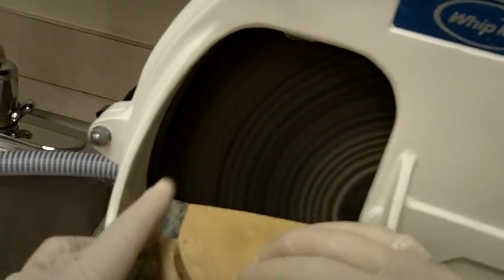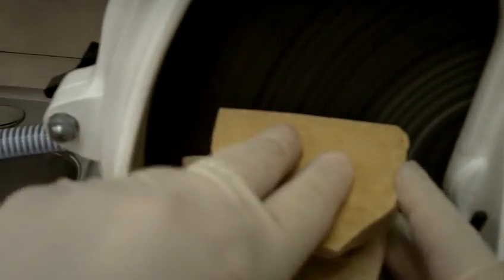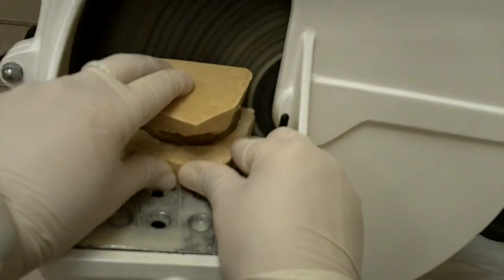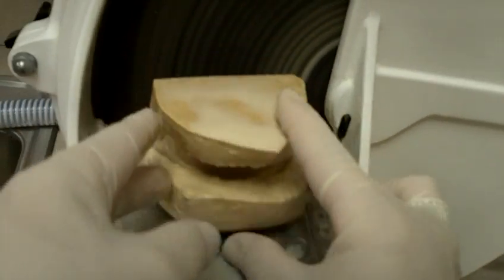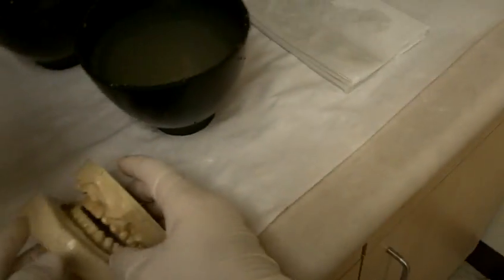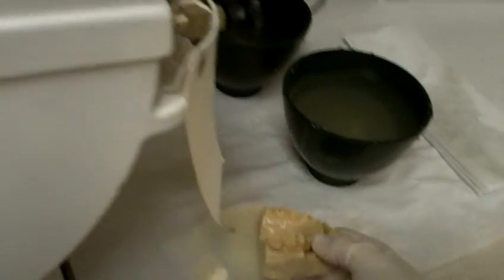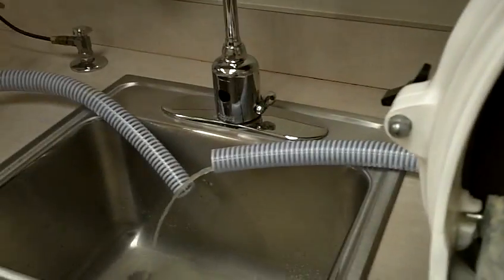You'll take both of them together, you'll put them together in occlusion, and now you'll trim them together. Trim the back together. Once you have the occlusion, okay, and I'm trying to do this and videotape at the same time, so hopefully I don't cut anything off, and I may have, but I'm trying to look through the viewfinder here. So basically I have both of them there, okay? Now the next part is going to be, and as you can see I did cut part of that tooth, but I'm trying to do this through the viewfinder as well, so it makes it a little bit more difficult.